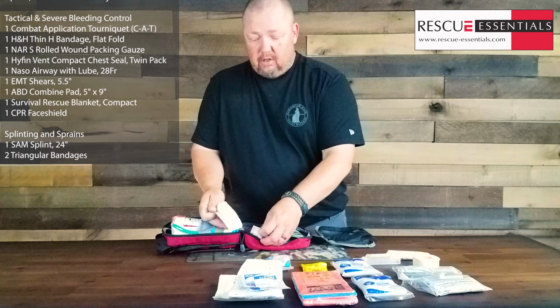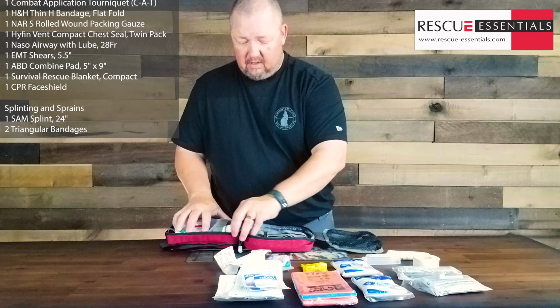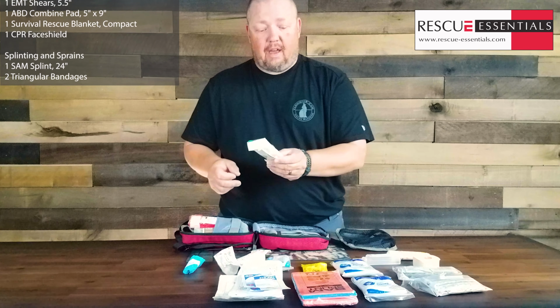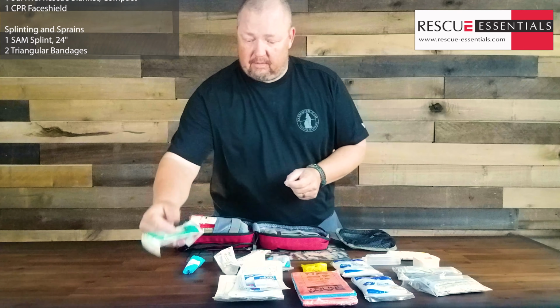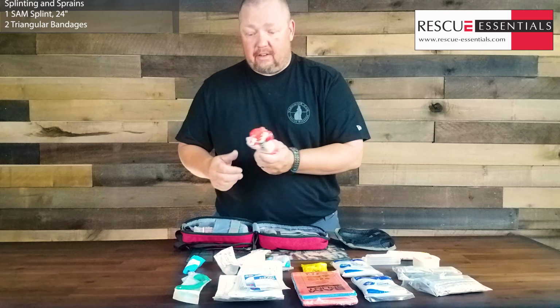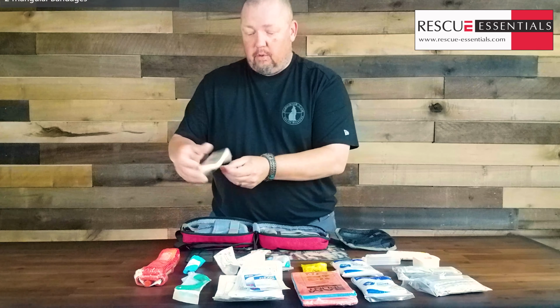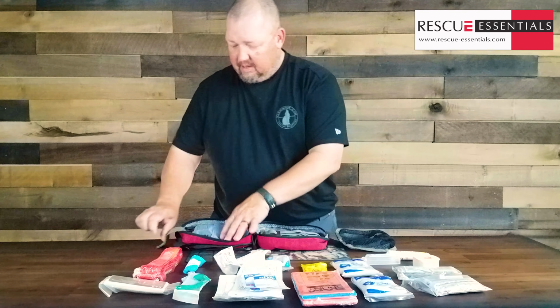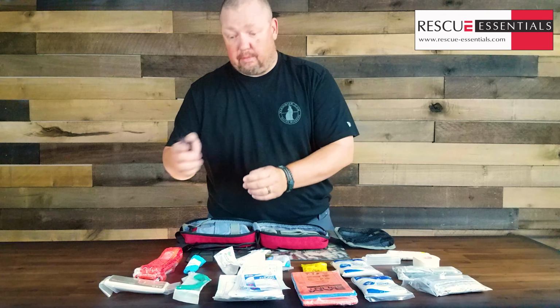We've got two gauze rolls. Okay? We've got a set of gloves. We have a nasal trumpet. We've got a CAT tourniquet. We have compressed gauze. Moving in, rounding this out, we've got some shears.